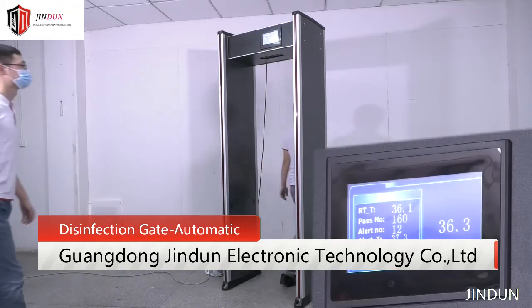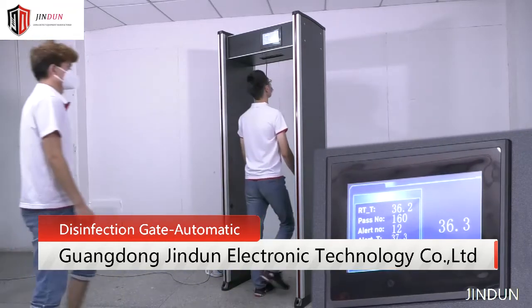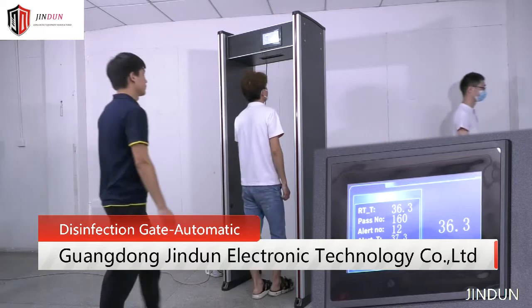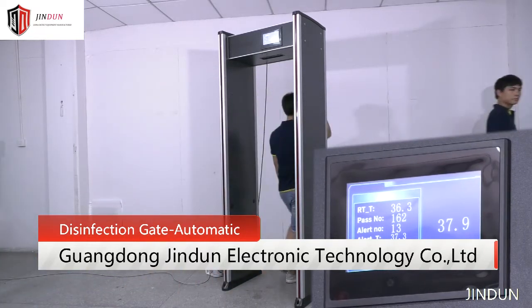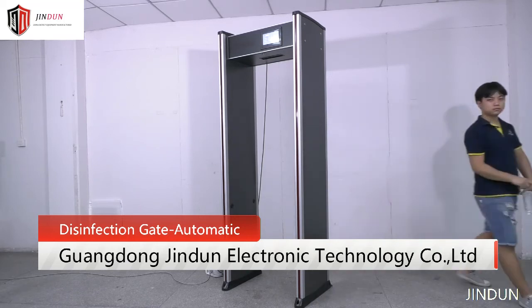Fast and quick detect body temperature. Stable and reliable performance. Screen shows measuring results with voice announcement, for your intuitive understanding.